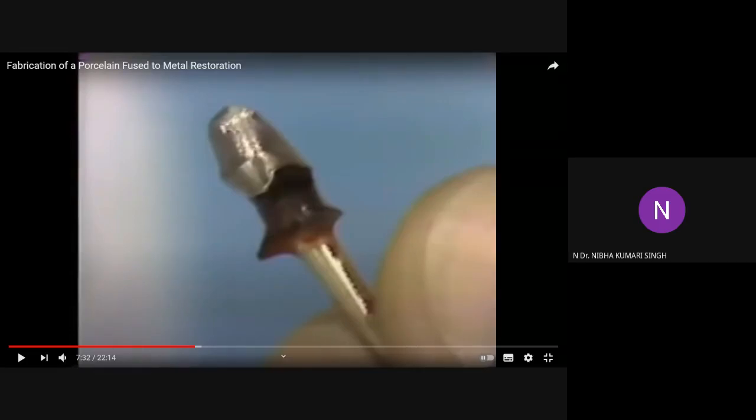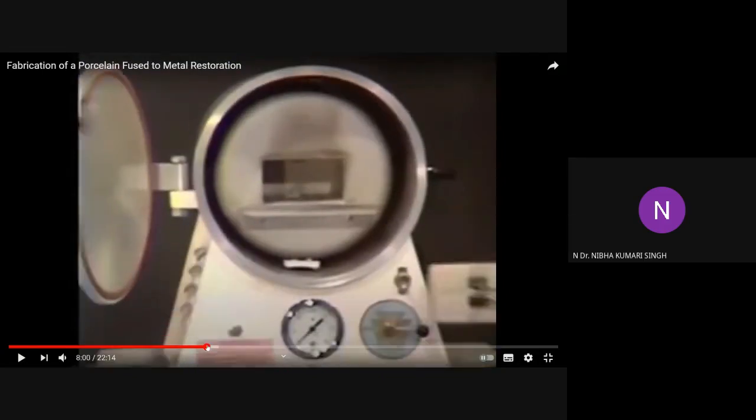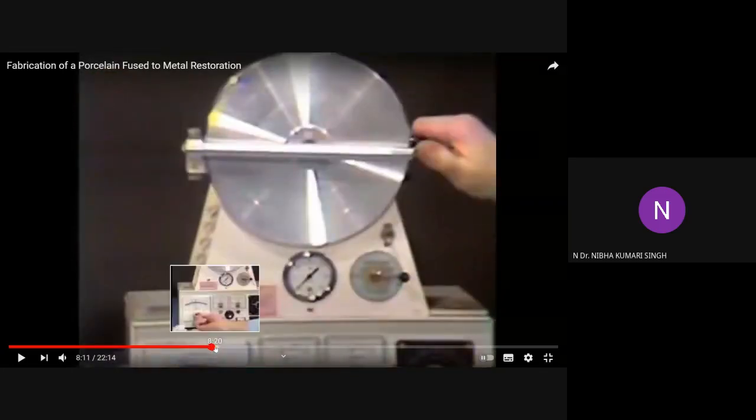So what is the next step you have to do? Already I discussed in metal ceramic. Now you have to place this in a porcelain furnace. Till now it was in the casting machine. When you place it in the porcelain furnace, whatever oxides are there inside the metal, that is tin oxide, indium oxide, those oxides will come onto the surface of the metal. That procedure is called degassing. You can see this porcelain furnace is a conventional form, a very old video. It is placed in the furnace, and the temperature is adjusted for the oxidation firing.